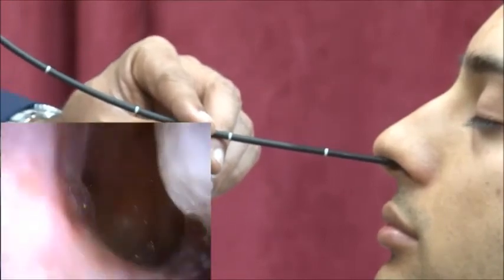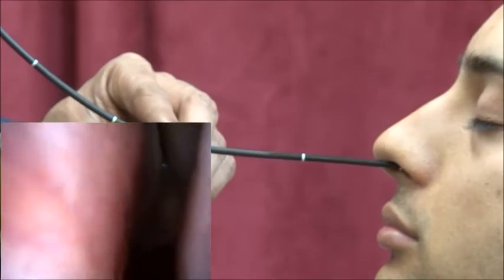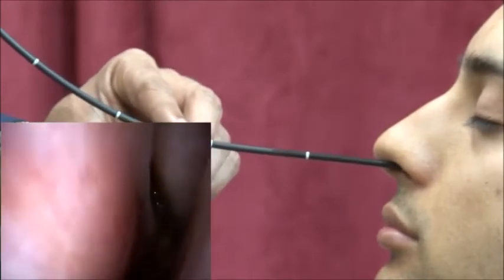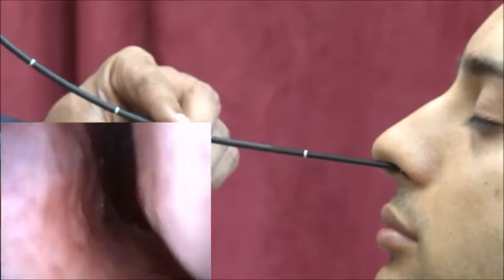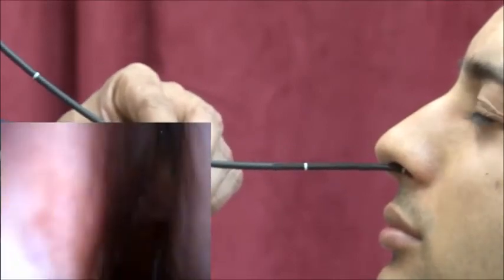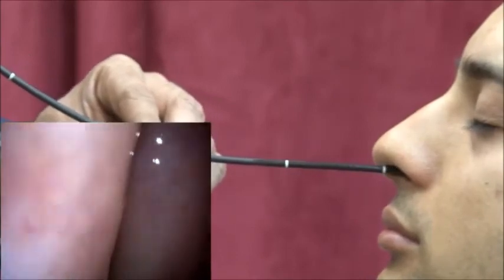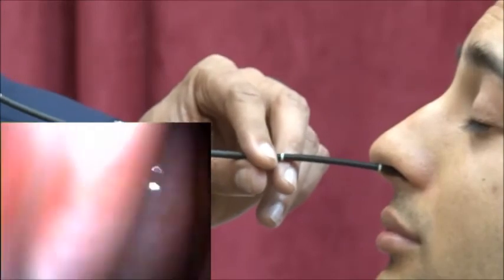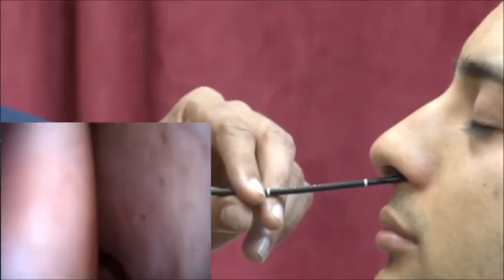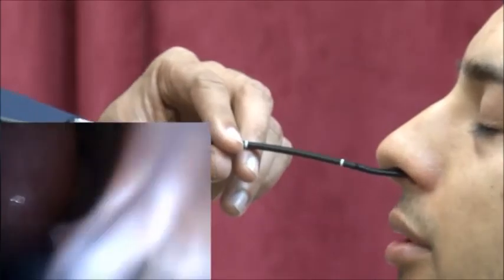On the way back out, remember to have a look in the middle turbinate area. So the septum is again on the right. That's the inferior turbinate, and if you go across over here slightly up, that's the middle turbinate. And then if you keep looking right at the top, that's the roof of the nasal cavity, just there. And this is a completely normal nasoendoscopy.